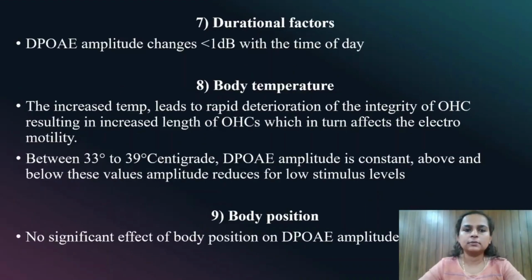Durational factors: DPOAE amplitude changes at less than 1 dB with the time of day, and body temperature, as body temperature increases, deterioration of the integrity of outer hair cells is seen. And body position does not affect DPOAE amplitudes.